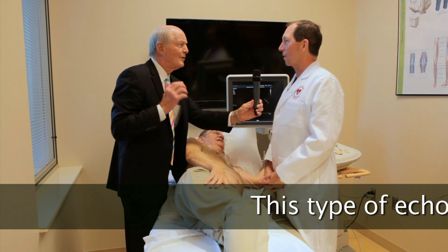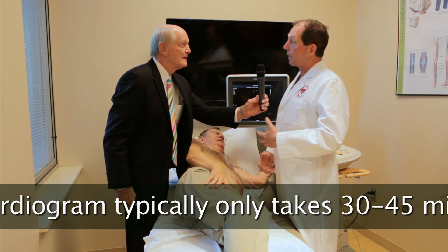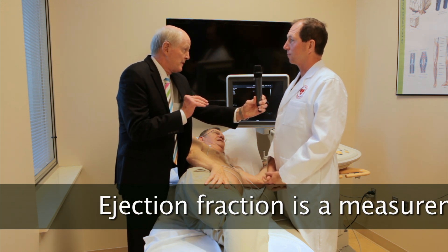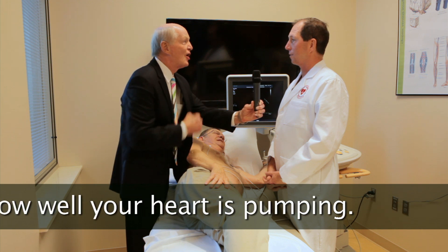Do you see the heart muscle move? Can you see it contract as you're doing it? We do, and we can calculate the volume and the pumping function — the ejection fraction. Is that one of the most important things you get out of it, the ejection fraction — seeing how strong the heart is beating?